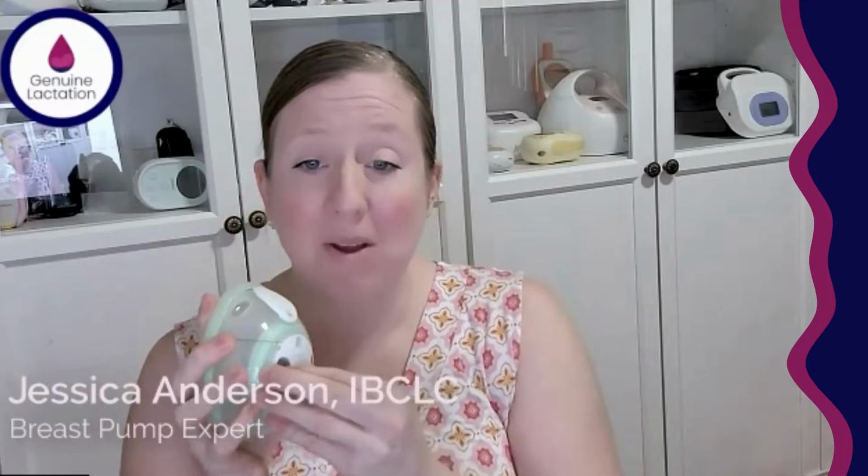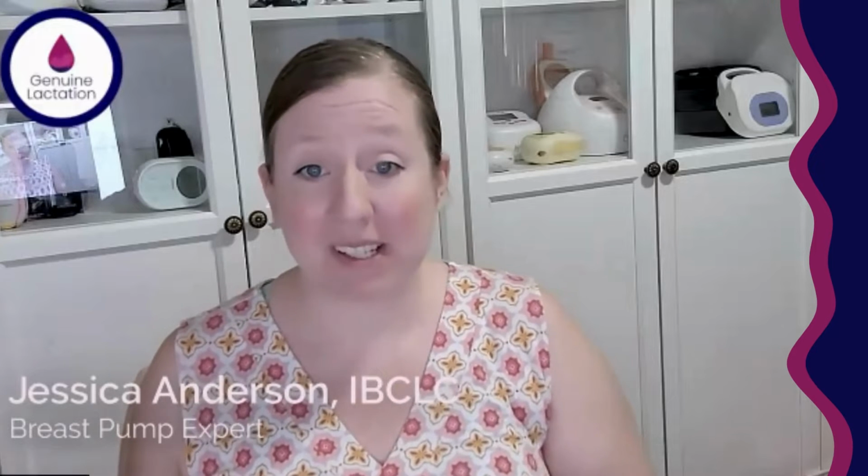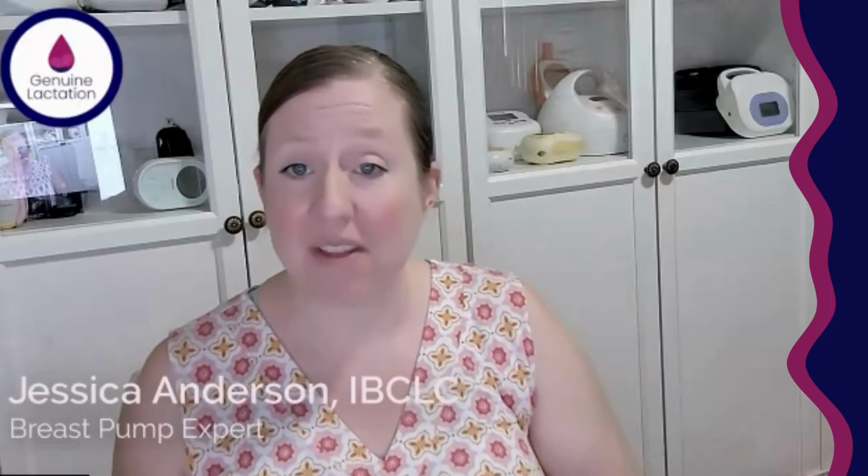So this cap here is what's going to actually be applied here and the tubing, which means if milk can get onto this side of the diaphragm, which does happen, milk can get through this air hole into your tubing, into your motor. Now, if you're using that with the Elvie Stride motor and it gets milk in the tubing, Elvie has just been replacing it. Elvie does have fantastic customer service. It's actually the only company I know of with 24/7 phone coverage.